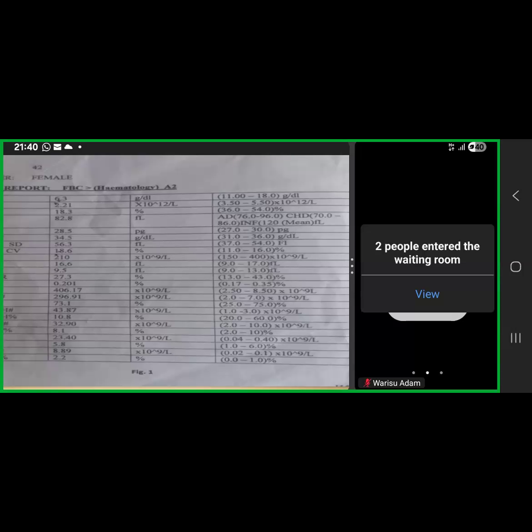Something has gone wrong in the bone marrow, and it is multiplying like, as my old boy would say, the bone marrow has gone mad. It is producing white cells like nobody's business.